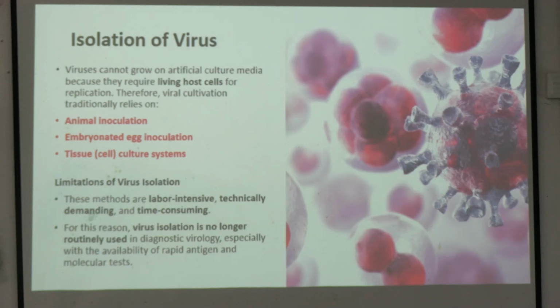ওকে, সো এই এগগুলোর মধ্যে অনেক লেয়ার্স আছে। অমলেট বানানোর সময় তো আমরা দেখি না কতগুলো লেয়ার আছে, রাইট? We break the egg and put it on the pan, right? But these eggs have multiple layers, which I'll show. প্রত্যেকটা লেয়ারে এক একটা ভাইরাস ইনকুলেট করা যায়। It is a very labor intensive process. Most probably you will not be able to see here because we don't have that facility. We are not doing it currently. Maybe in the future we'll do.